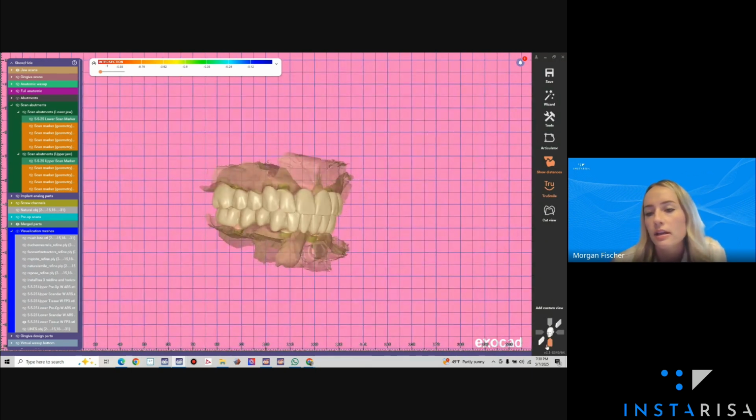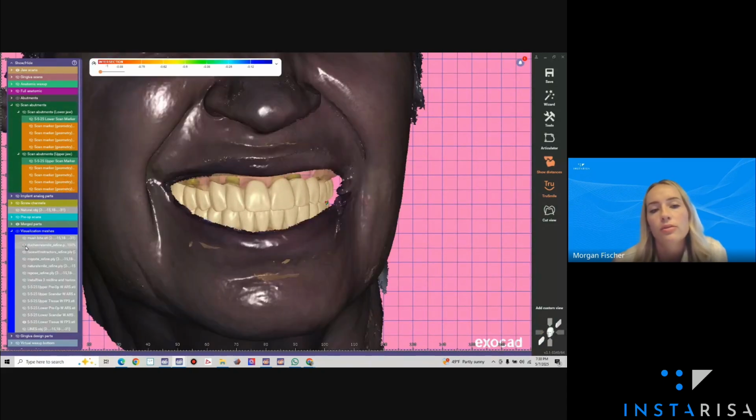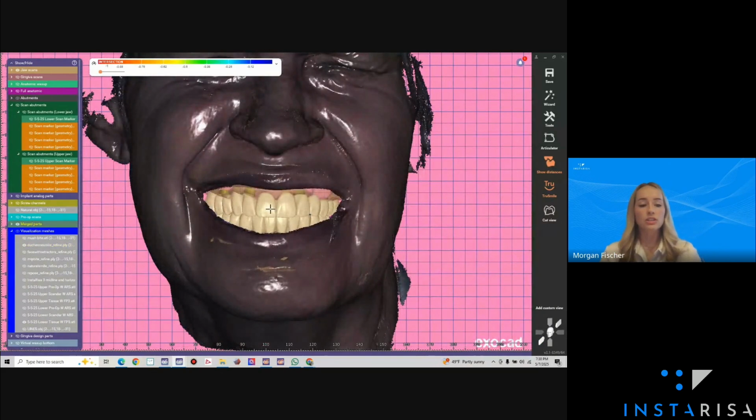Another thing that's just great is showing the patients these preoperative scans here. I believe that this patient was originally planned for an FP3, and then upon the pre-design, there was communication that, due to this patient's extreme lip mobility, let's go back and maybe consider doing an FP2 or FP1 for this patient.